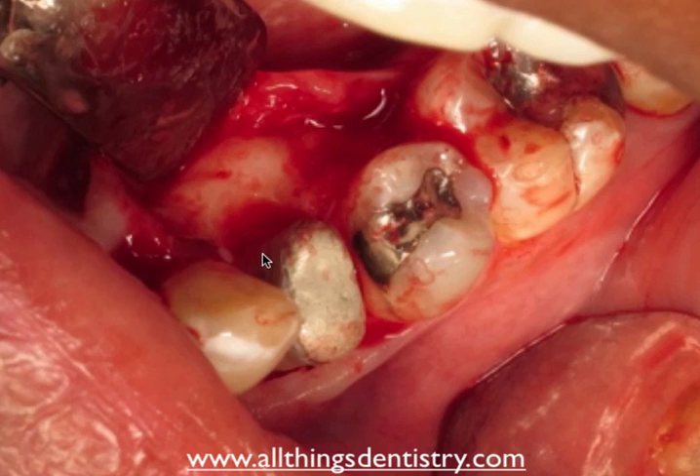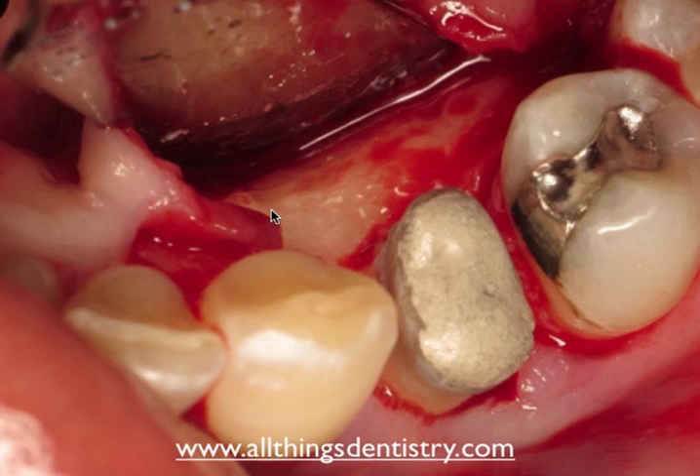I do have 3 millimeters from the osseous crest to the intended finish line, but in doing so I created a concave bowl on the lingual. In retrospect, I should have removed the lingual tori first. What we're going to do now is remove those tori — you can use chisels or burs, whatever you prefer. In this case we didn't have chisels available, so we used a round bur. It was fairly quick — only took about 2 minutes.